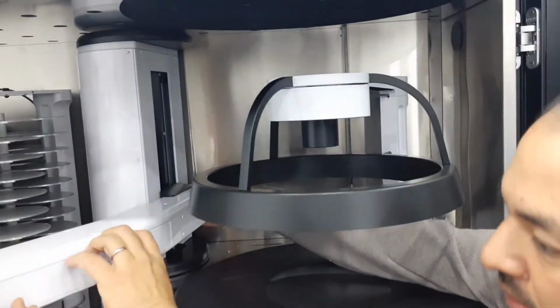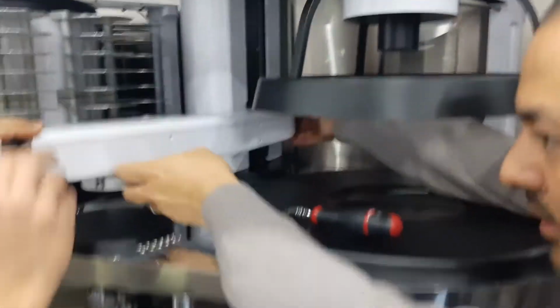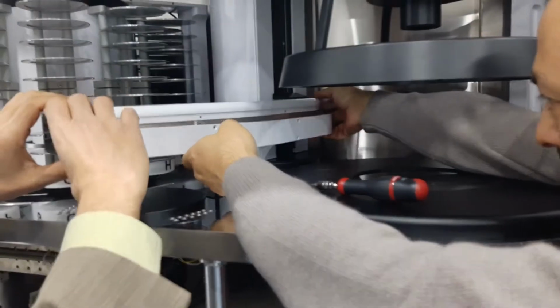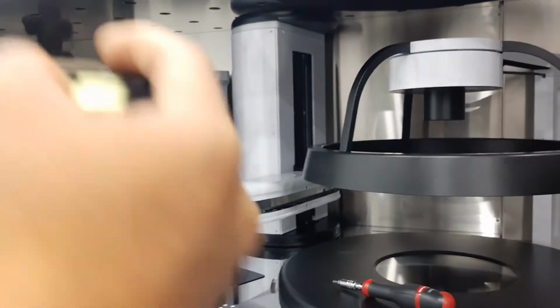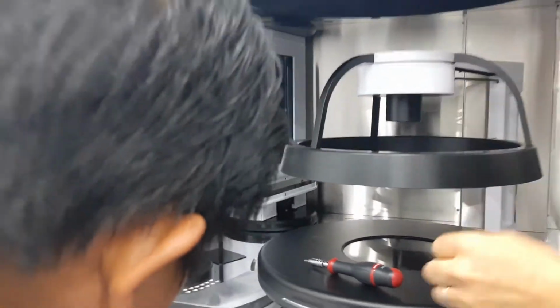Yeah, I think we can take it off. Ta-da. I'll do it from the other side.